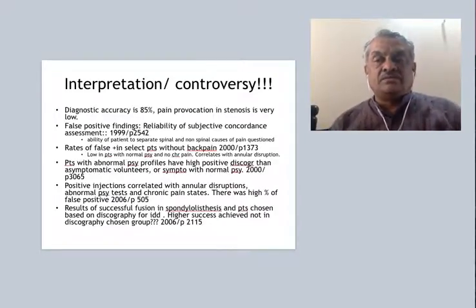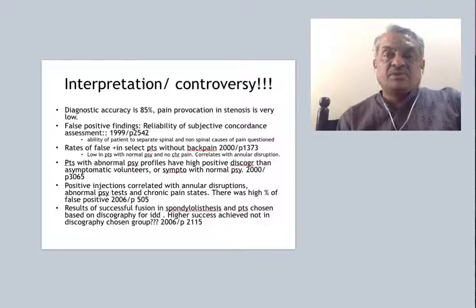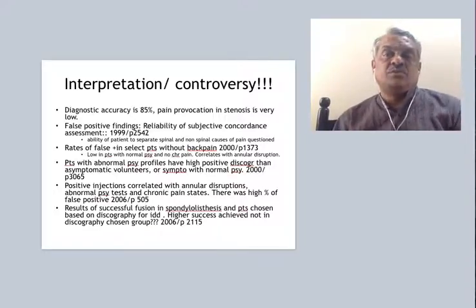Now, there are some mentions in the literature as well as common parlance, when we are talking in a group or in meetings, where people talk about discography as controversial. We must remember that the interpretation of the discogram is controversial. The act of discography is not controversial. There is a diagnostic accuracy of 85%, and the pain provocation in case of stenosis is very low, because primarily in stenosis you get more of numbness and more of claudication.